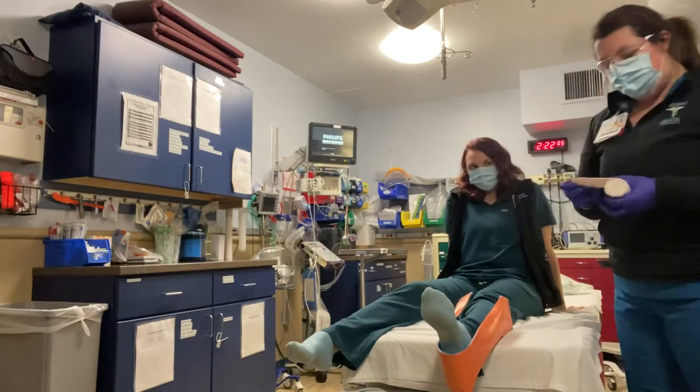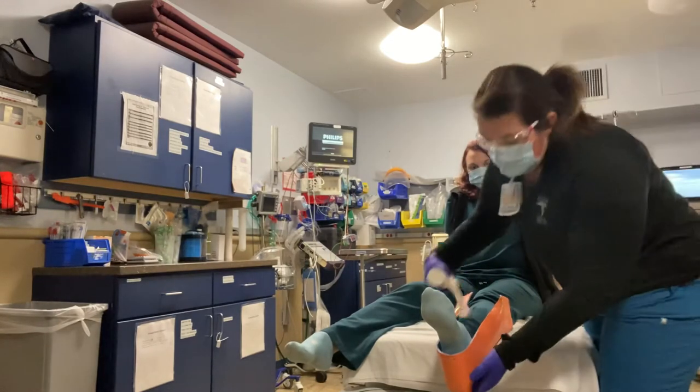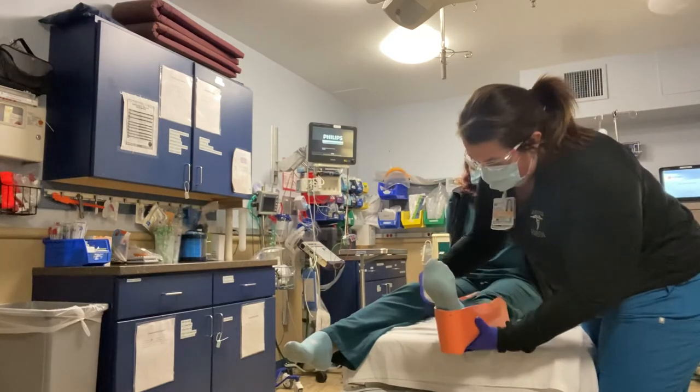Now I'm going to apply an ACE bandage while supporting her leg.